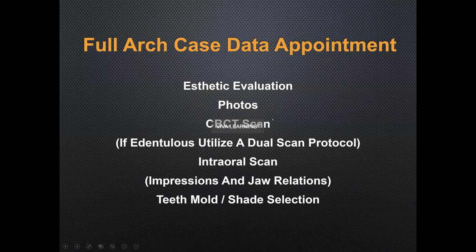We'll get intraoral and extraoral photos, a CBCT scan. If edentulous, we'll do a dual scan of a newly made nice denture, ideal denture with the ideal occlusal schemes, or we use an intraoral scan. We can also take impressions or jaw relations the analog way.